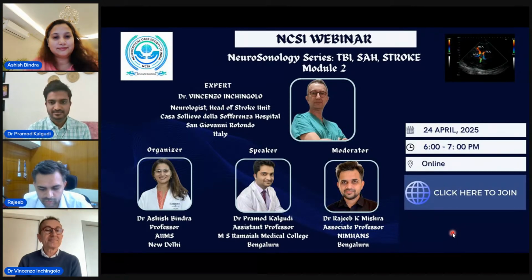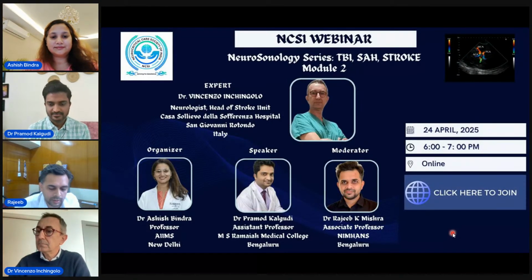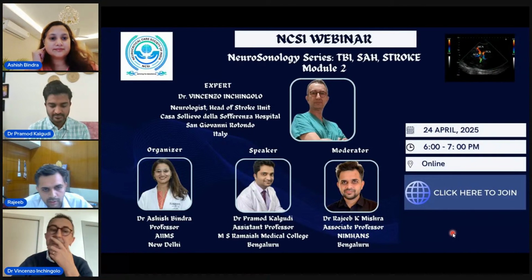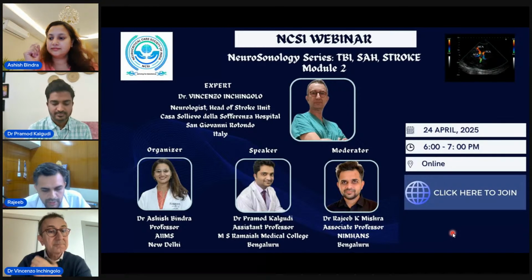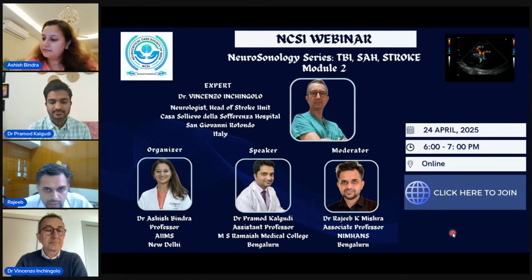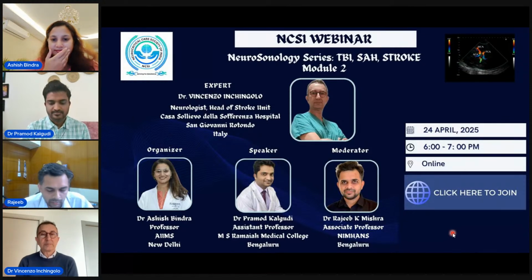Thank you, madam, for this wonderful introduction and start of the session. I welcome all again to this Neurocritical Care Society of India webinar. This is part 2 of neurosonology. To host the session, we have two eminent faculties. First one is our speaker, Dr. Pramod Kalgudi. He is assistant professor in MS Ramaiah Medical College, Bangalore. He trained from NIMHANS as a DM student. Then he got a neurosonology fellowship under the mentorship of Professor Vincenzo in Italy. And now he's going to deliver part 2 of neurosonology, on the use of TCCD in various neurocritical care settings. I welcome Dr. Pramod.